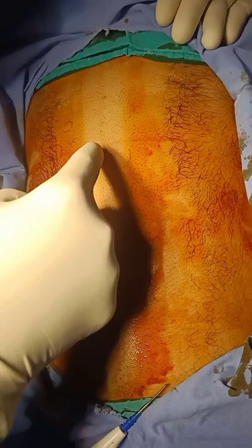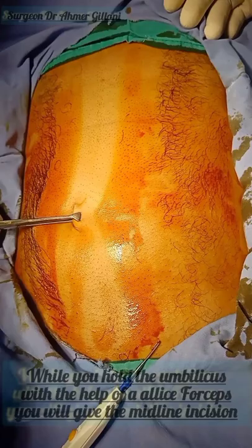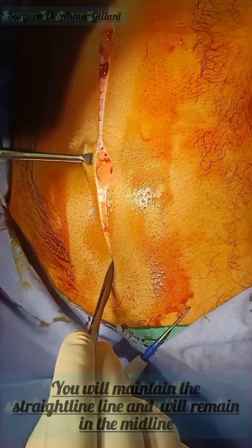I will show you how to open the abdomen. After proper washup, gowning, gloving, painting, and draping, you will give the midline incision. You will give the incision at the place where the hairlines meet. While holding the umbilicus, you will give a straight incision starting just below the xiphisternum to just above the symphysis pubis.